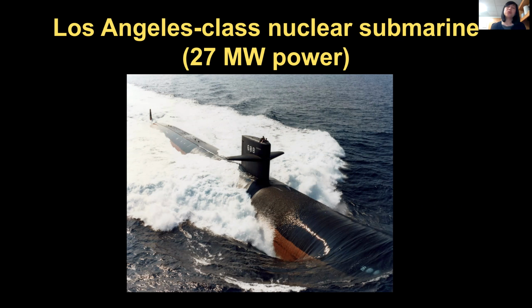Closer to home, we're located out here in Charlestown in the Navy Yard, which is right adjacent to the part of Boston where MGH is. So our research campus is here, and we were estimating that when those gradients are played out at maximum gradient strength, it takes about a quarter of the power from the small town of Charlestown to run this.